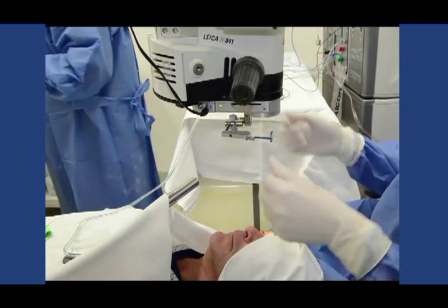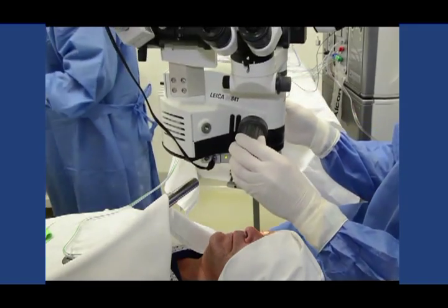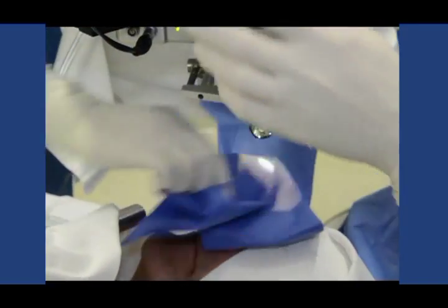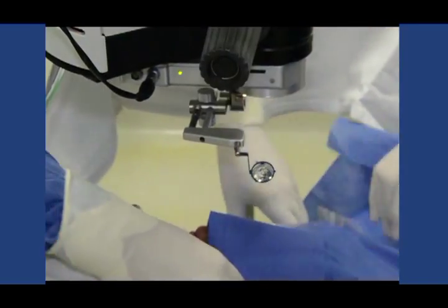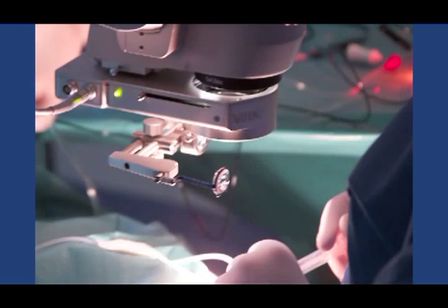The surgical lens is attached to the LPU and then suspended directly over the patient's eye when viewing the retina. All three lenses provide an inverted image of the retina that is subsequently corrected using a re-inverter device, such as the Volk Roles Infinity.